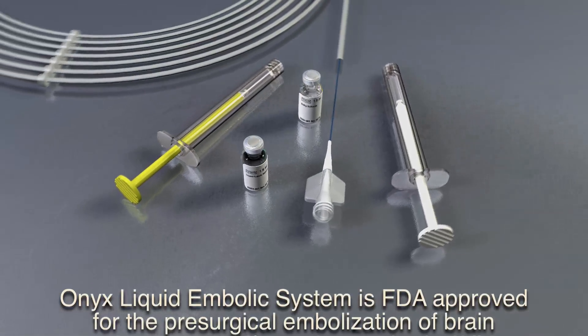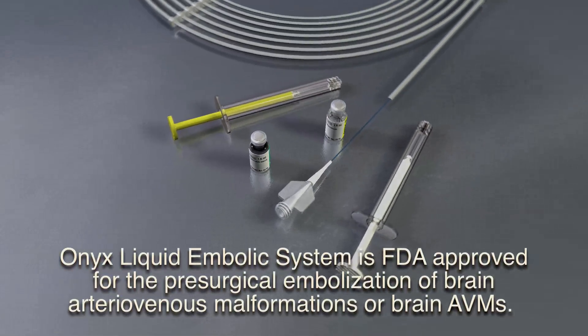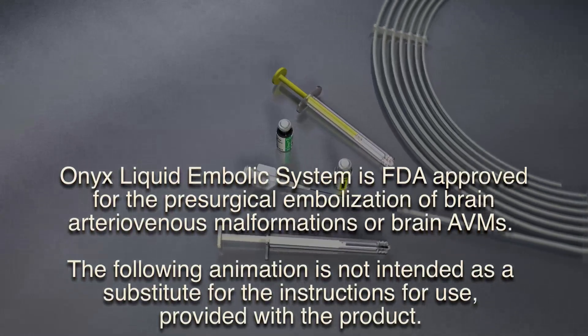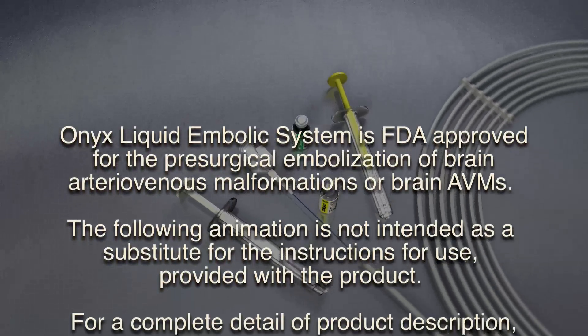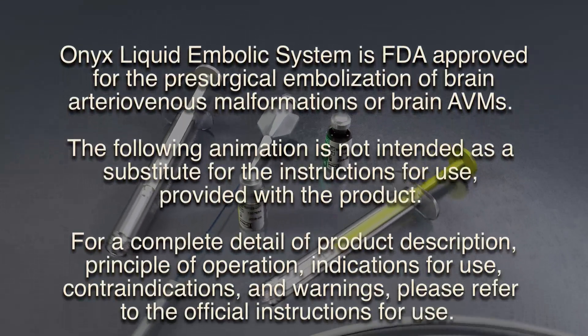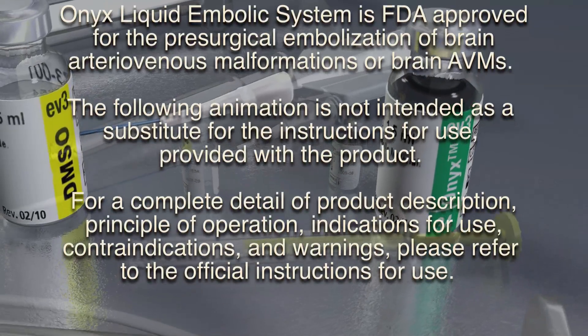Onyx Liquid Embolic System is FDA approved for the pre-surgical embolization of brain arteriovenous malformations, or brain AVMs. The following animation is not intended as a substitute for the instructions for use provided with the product.